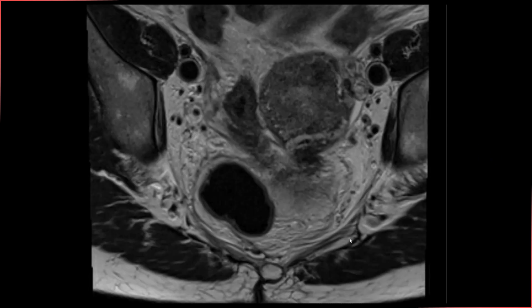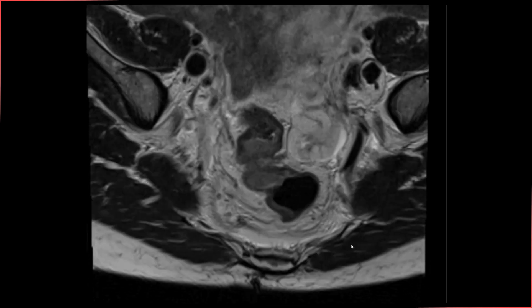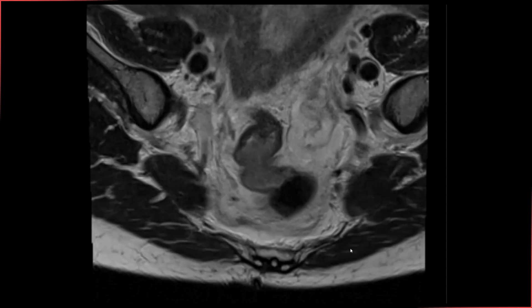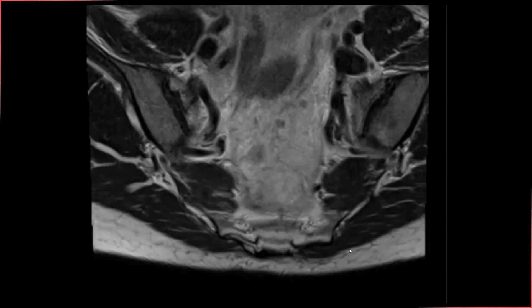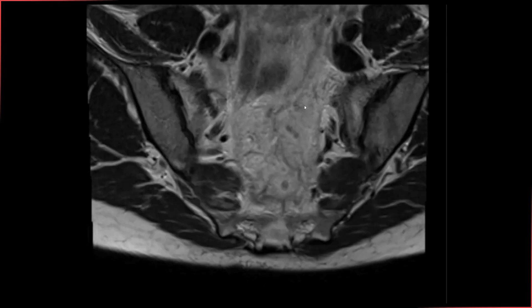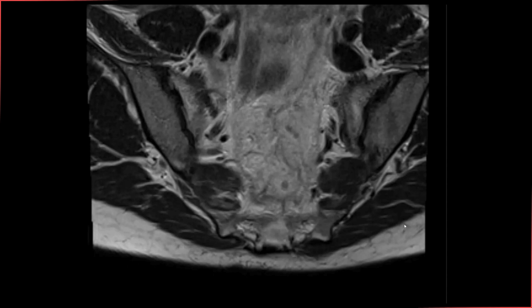We don't see any lymph nodes in the mesorectum, pelvic side wall, or elsewhere in the pelvis. There are small lymph nodes along the sigmoid mesentery and along the superior rectal vessels, but these are not suspicious — they are quite small and have fairly homogeneous signal. This is something we would cover in more detail in our rectal cancer staging module in the rectal MRI series.